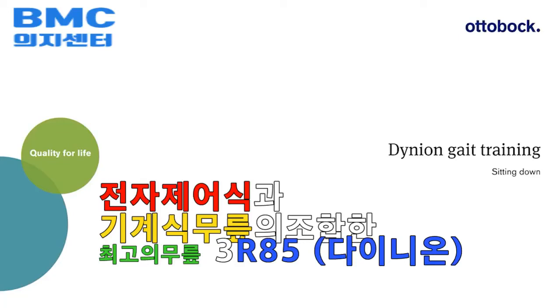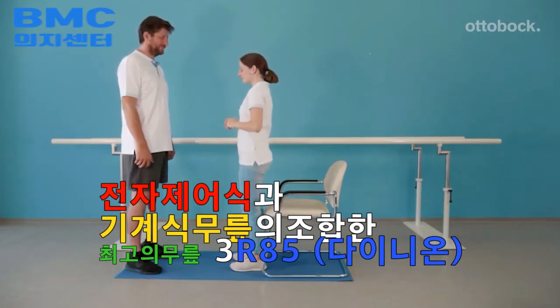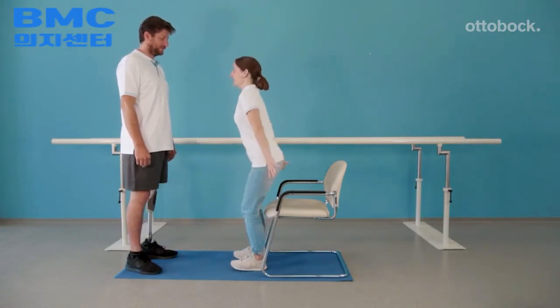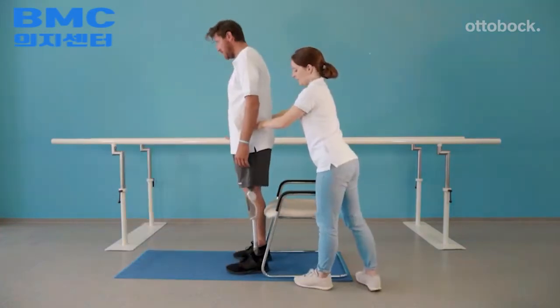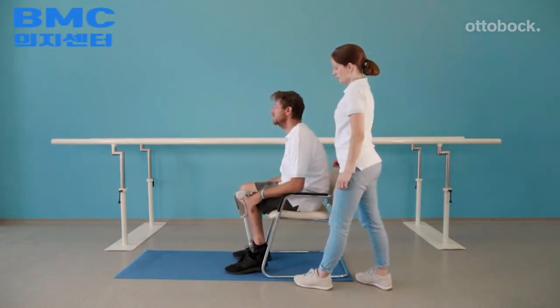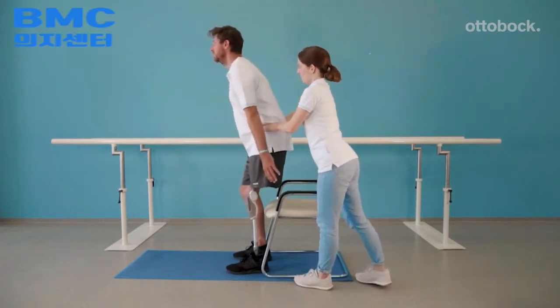Practicing sitting down helps to relearn loading both legs equally. Demonstrated here is how to distribute weight evenly on both legs and to keep the center of mass over the feet. Follow the principle: nose to the toes. Move the upper body forward, reach back with both hands, and sit down fluidly. The pelvis should symmetrically flex as the model sits down.